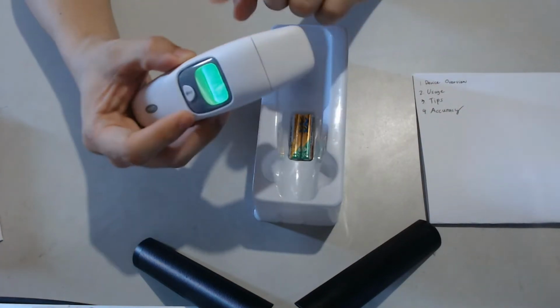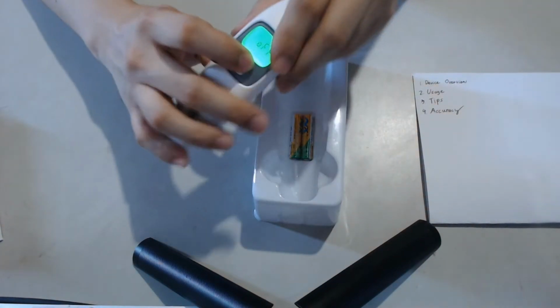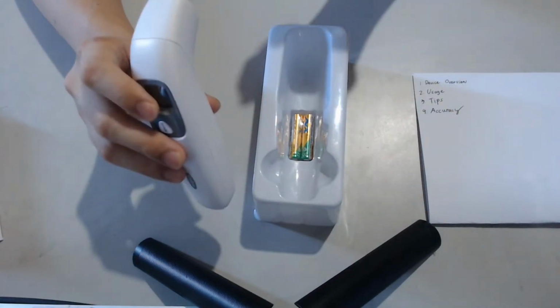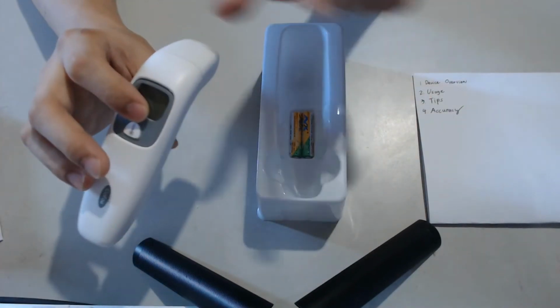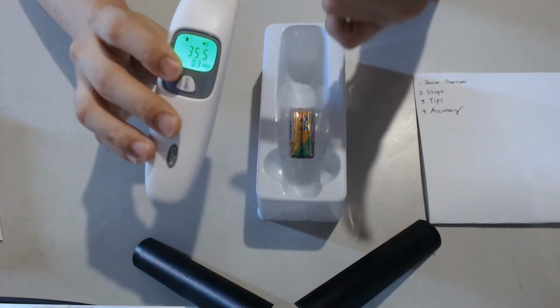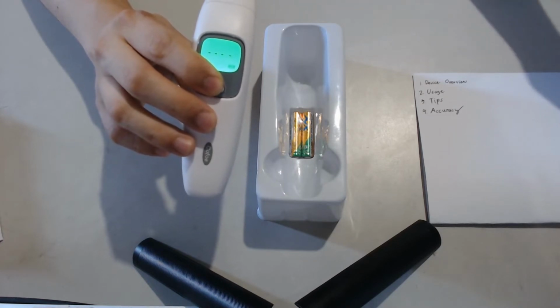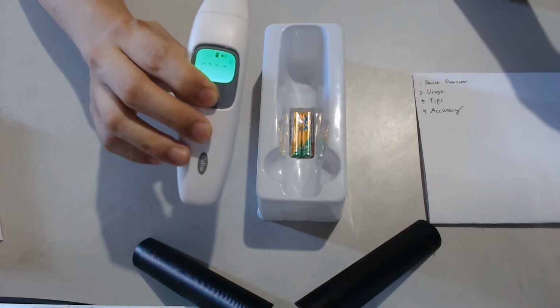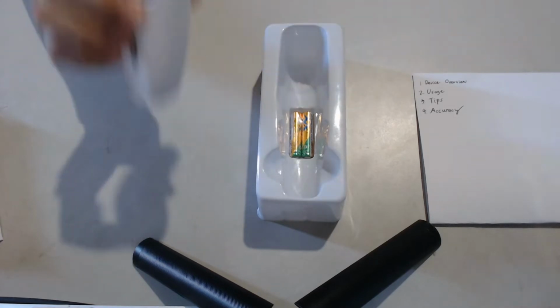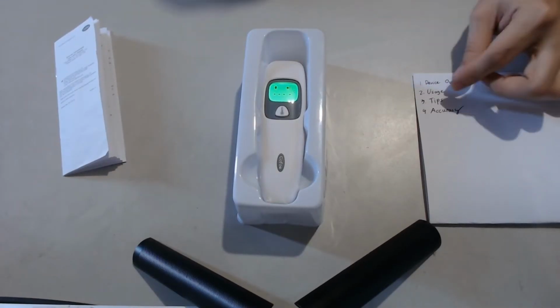This, however, cannot be used to determine whether you have a fever by taking a measurement of your forehead and using whatever the output is. You cannot use that. You have to use one of the standard measurement modes. To reset it, either turn it off and on or hold it again for 3 seconds. 1, 2, 3. There, and back. So remember, it's not in the manual.